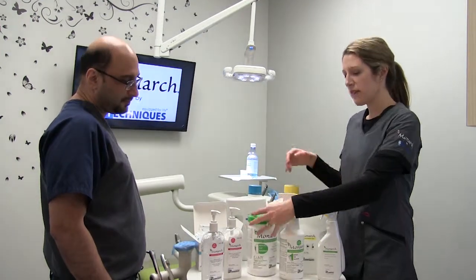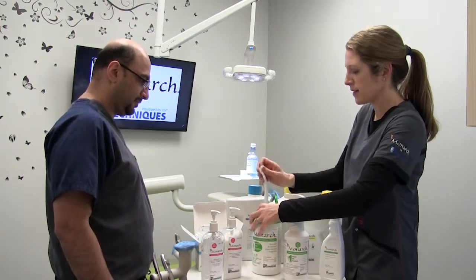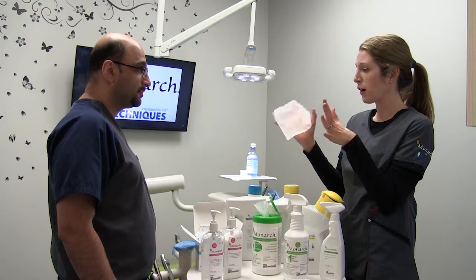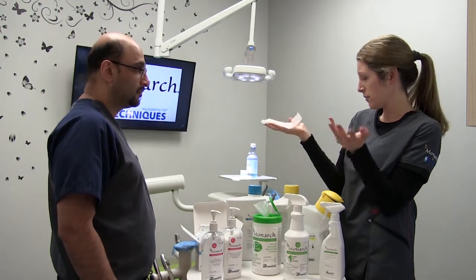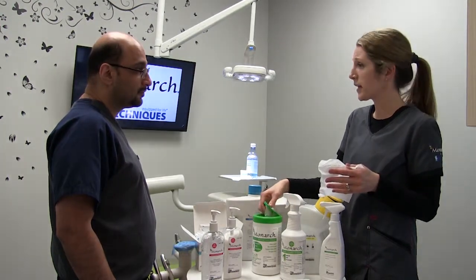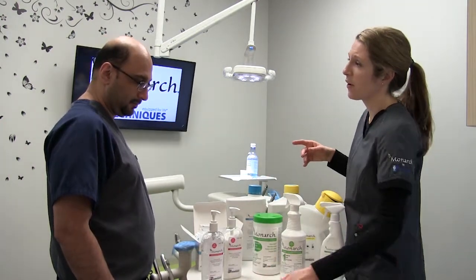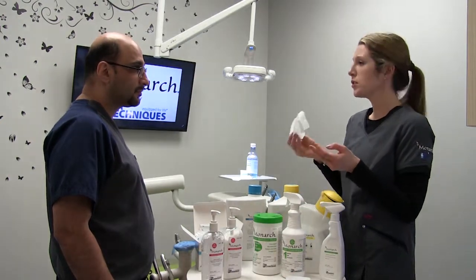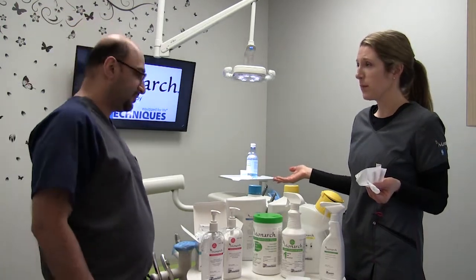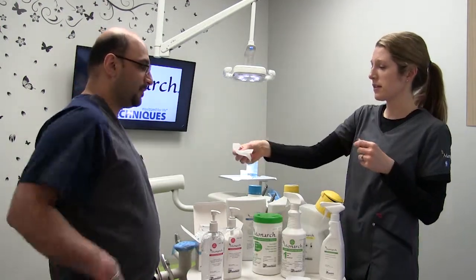Moving on to our surface disinfectants — we have a spray and wipe form. The wipes come in two different sizes: the six by six and three quarter, and we also have a seven by nine wipe. It also comes in spray form. It's a one-step, one-minute kill time, safe to use on your equipment, and it won't yellow your equipment like some others on the market do. It's so safe that you can use it without gloves. Of course, if you're wiping down a dirty room you use proper PPE, but if you're taking a pan on a patient and quickly want to wipe down the handles, it's nice to have that option.